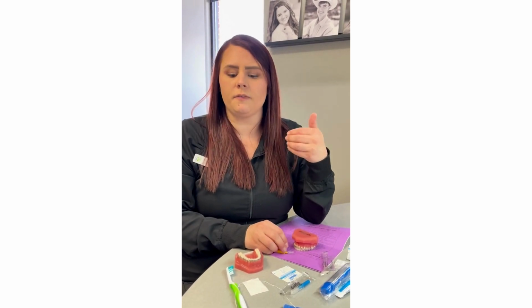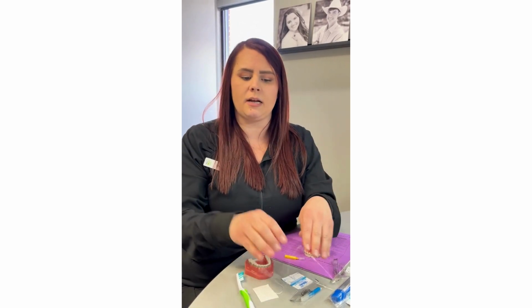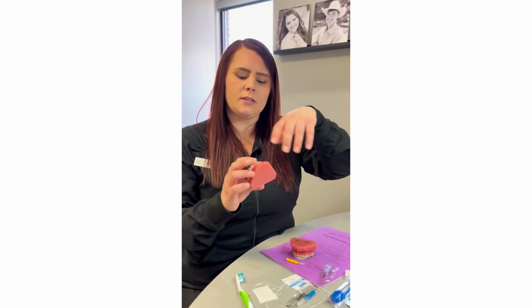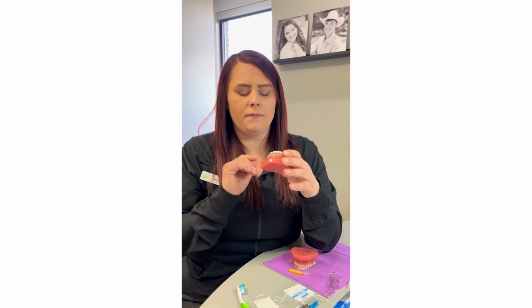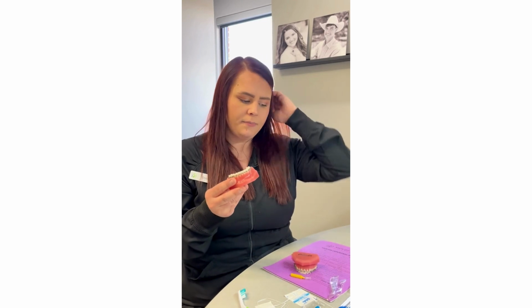Water flossers are nice. They help break up a lot of things on the surface, but you really should be going through with thread floss on a daily basis to really get up underneath those tissues. Sometimes we have things where our bracket breaks, maybe as things are moving, something starts poking, you might get a wire that slips out from time to time, or if we're closing space, you can get pokey wires that way.